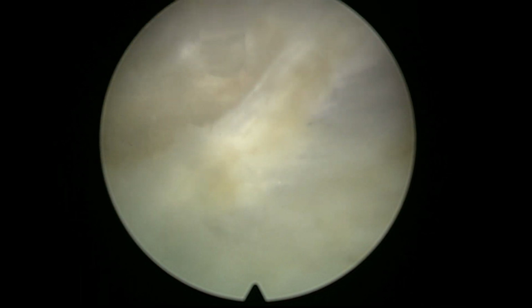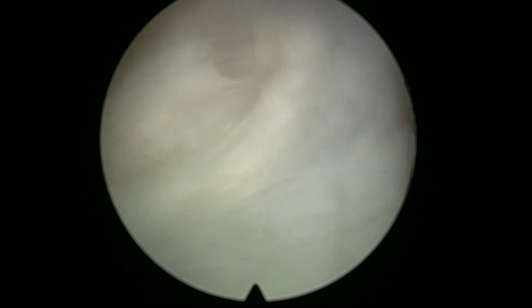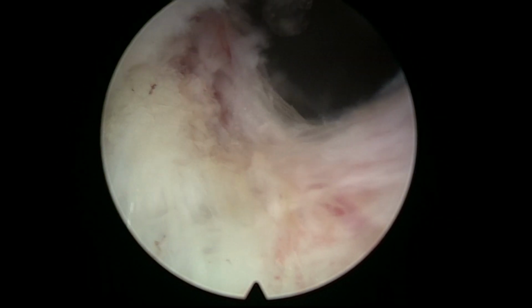And I felt adventurous that day, and I decided to try to morcellate. Also, probably because I thought the adenoma was not very large. Sometimes you have the full house, the large glands, the prostate cancer. You do a rectal examination, and you can feel the stony, hard prostate, which was the case in this man. He had a very, very rigid prostate on palpation, but I thought maybe the adenoma is not such a large one, and if we had to resect, it would be reasonable. And I took the risk of morcellating because I thought maybe if I'm successful, then it will be very fast and very nice. There you are.